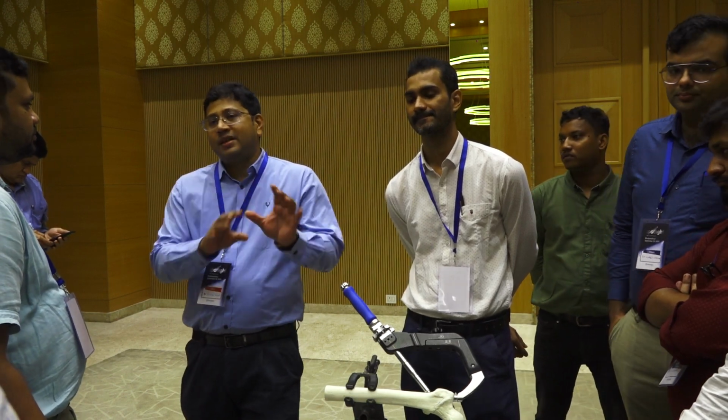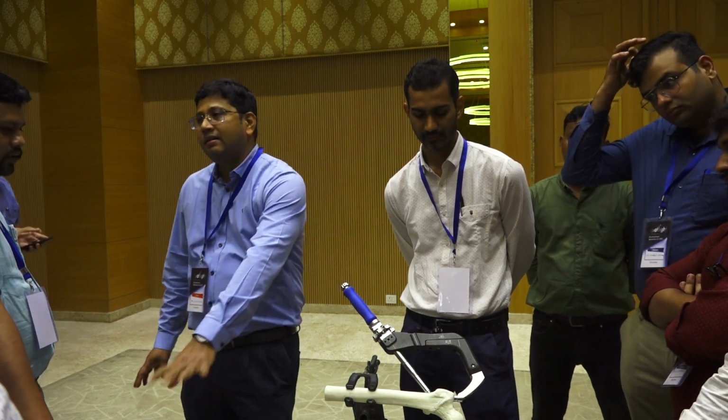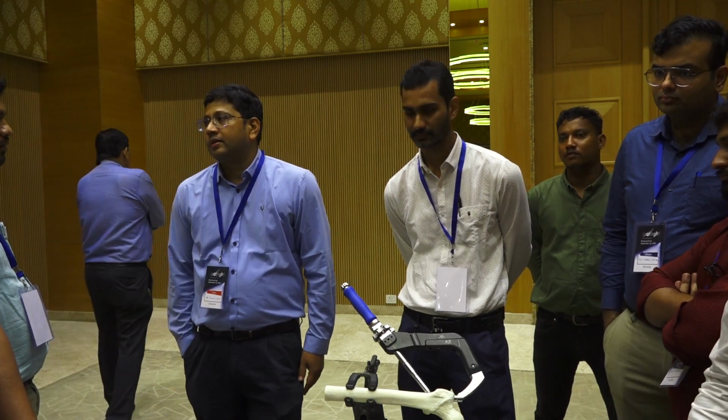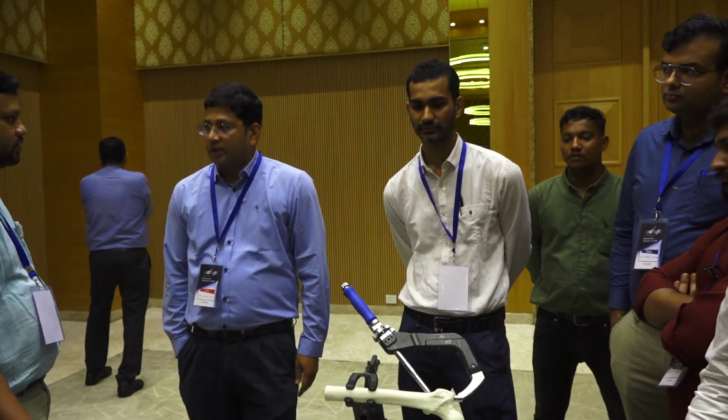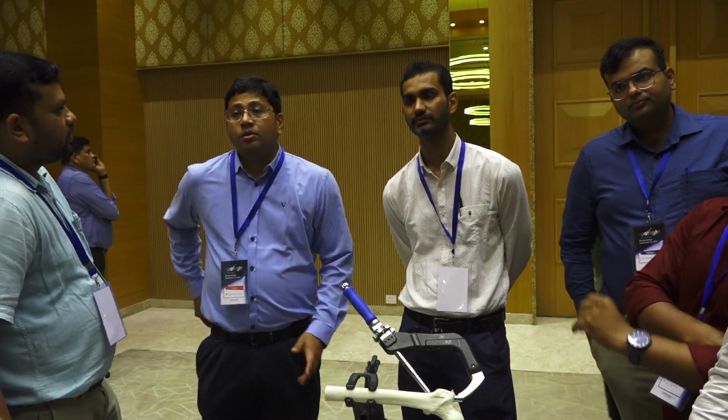So in that I am just putting a static locking of the proximal blade, and I will not put any distal lock. They will be dynamic on the distal. So that is the way. If it is distal, only a dynamic screw will be.